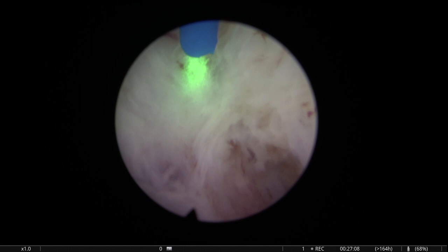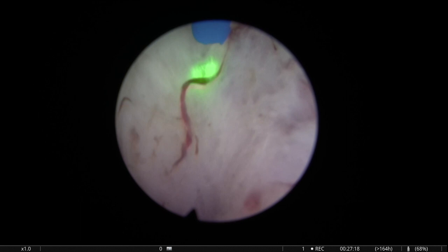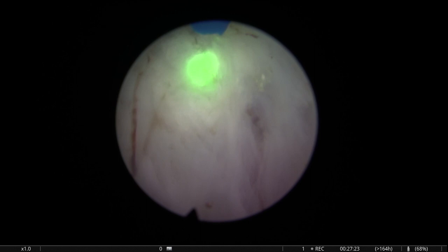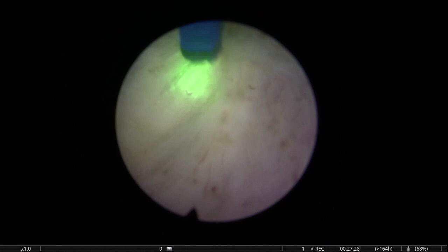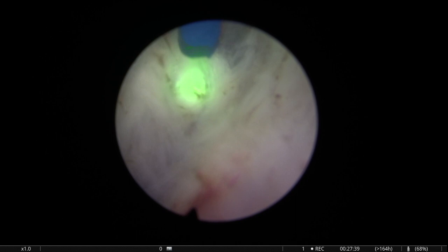Sometimes you're more in doubt, and then you have to start looking around a little bit, trying here and there, and see which could be the good plane. If you get the information that the plane is a little bit deep because you're starting to see capsular looking tissue, then you have to correct. And this is it, really. This is the essence, I would say, of the dissection of the plane.